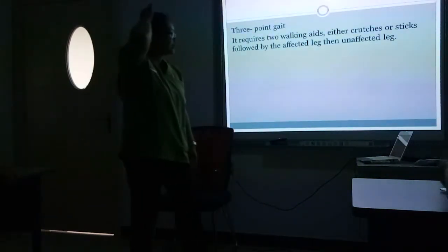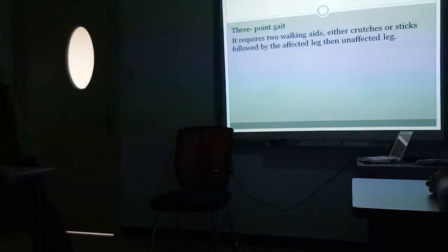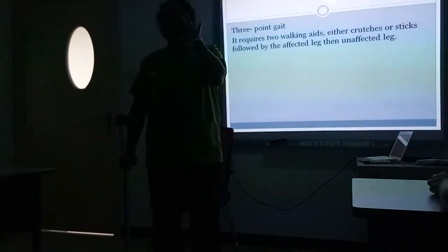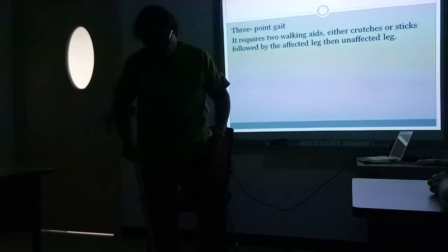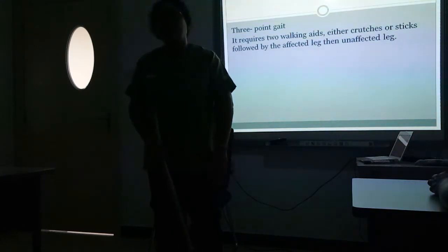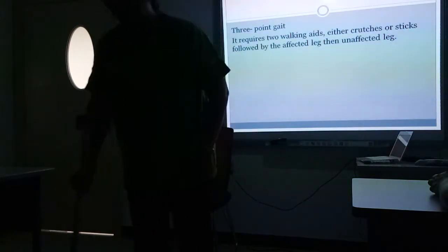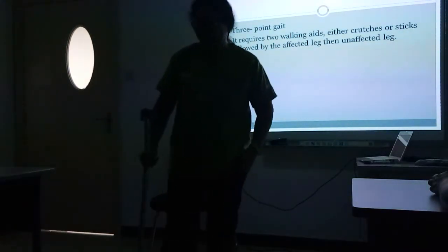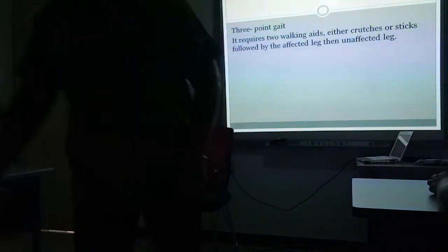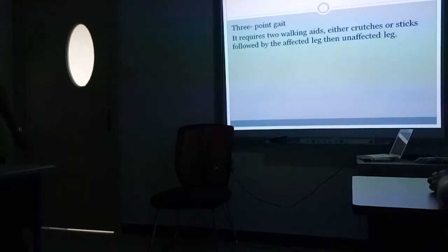Okay, 3-point gait. It requires 2 walking aids, either crutches or stick, plus the affected leg. Okay. Ito. Pag ganyan, meron kasing non-weight bearing, meron tulang na i-touch mo lang. Ito yung talagang grabe yung injury dito. Okay? One, two, three. Ganyan.